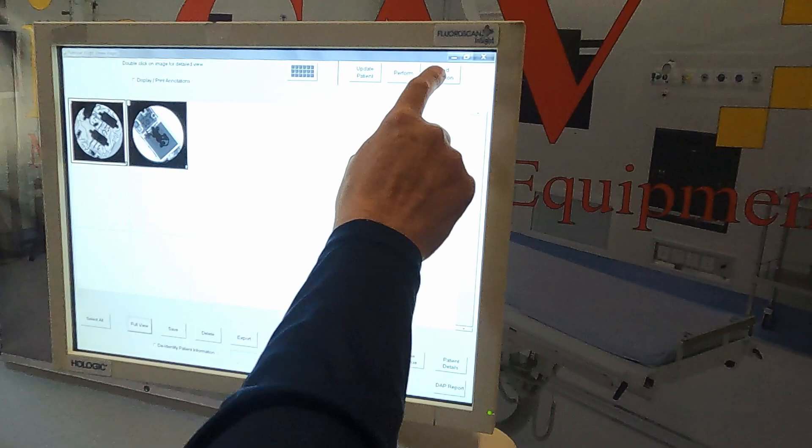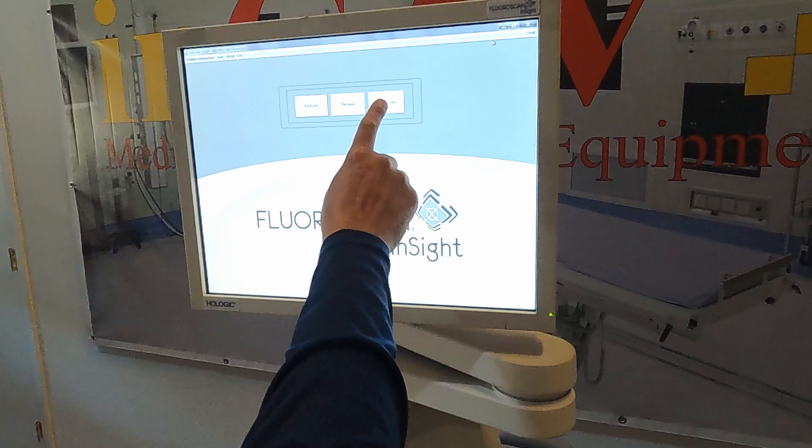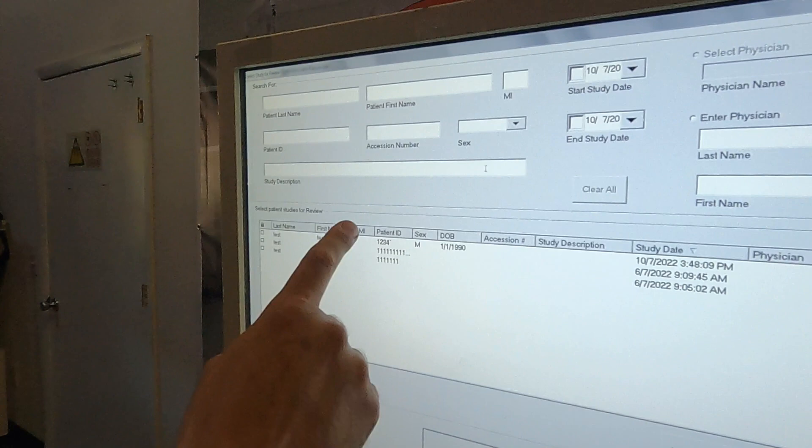To finish the session, just click on end session and go back to the home screen. Besides perform, we also have shut down to turn it off and review. On review, we can see all the studies we performed.